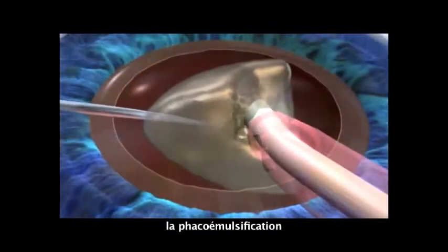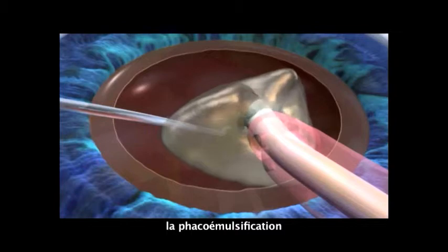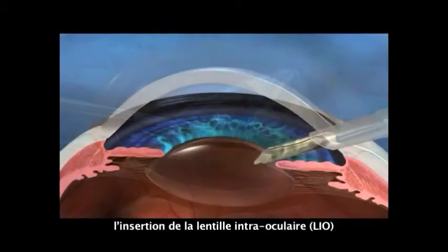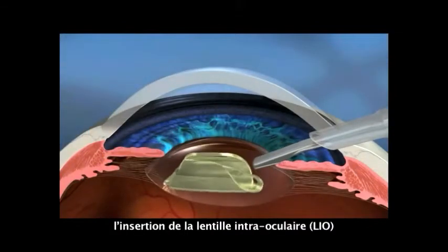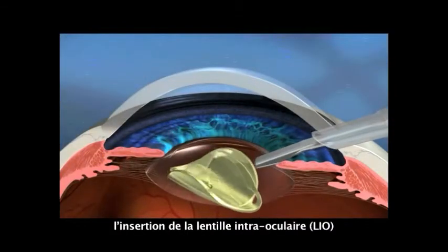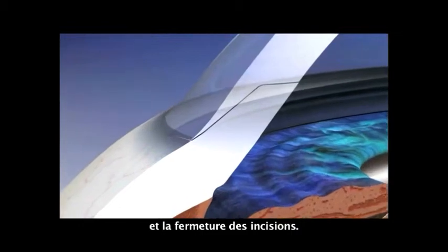Phaco emulsification, intraocular lens insertion, and incision closure.